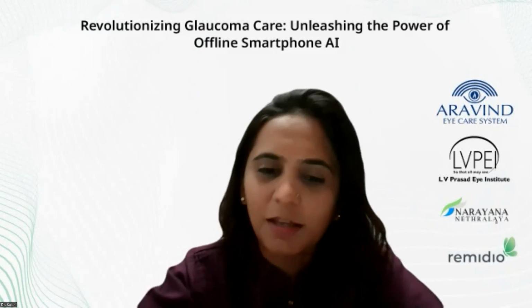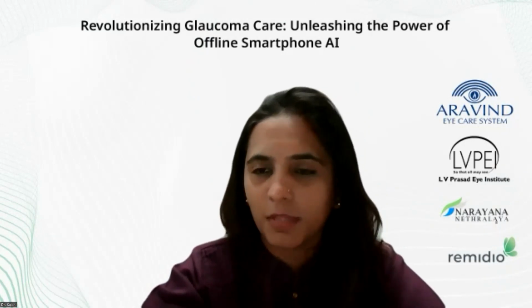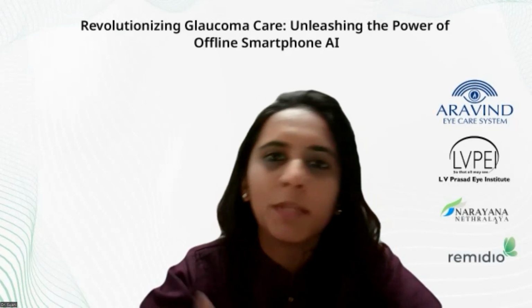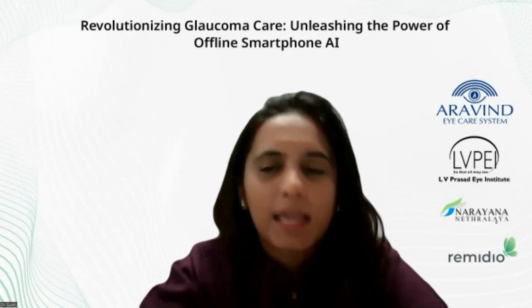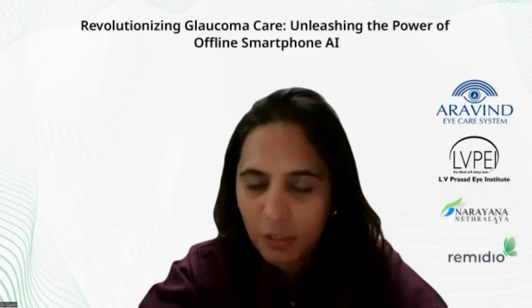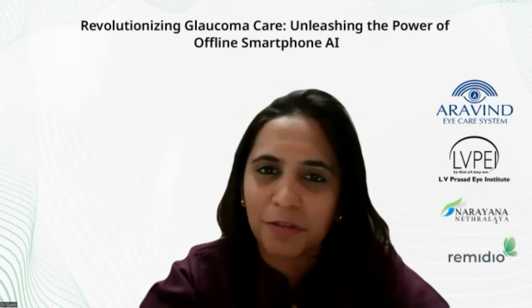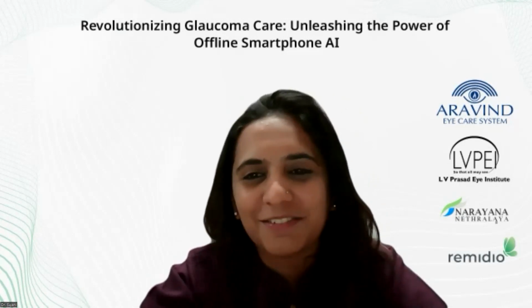We still need it. But AI can be used as a screening for those patients whom you're suspecting glaucoma and you need these investigations done. At least for those patients, you can definitely. So this AI is something that you have to do for at least all your patients, whoever comes and you have that suspicion. But visual fields and OCT, you definitely can't do away with it. It's part of the glaucoma workup, which has to be there.